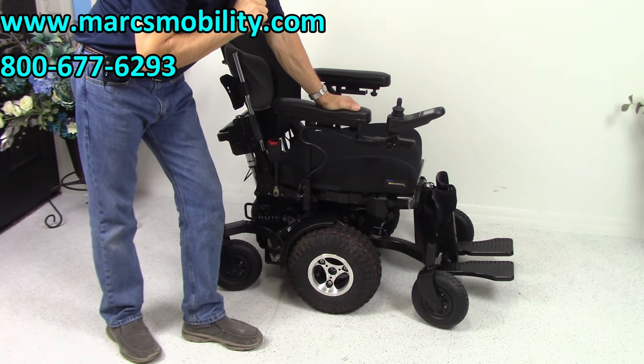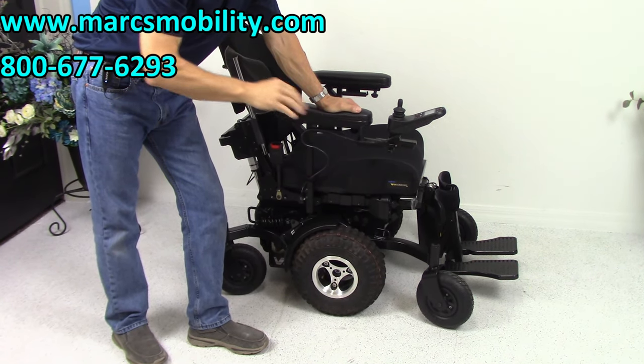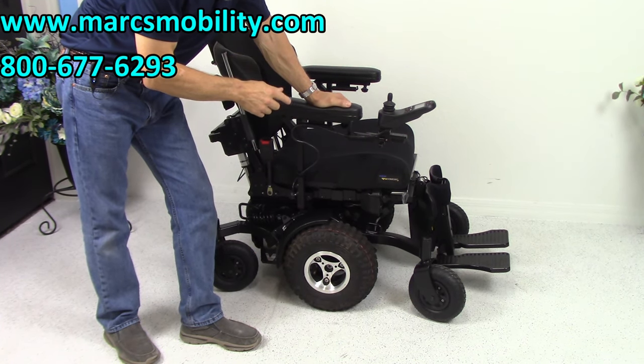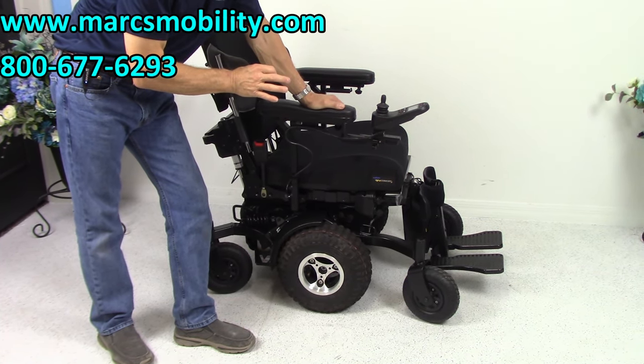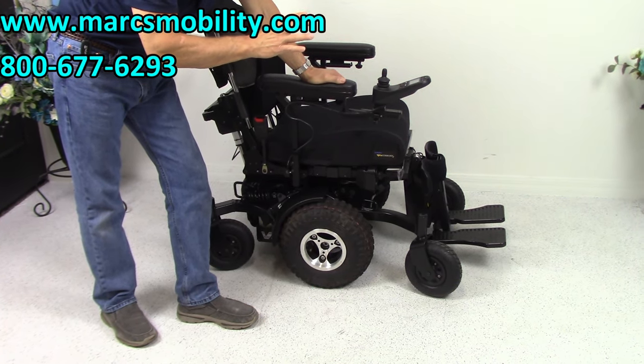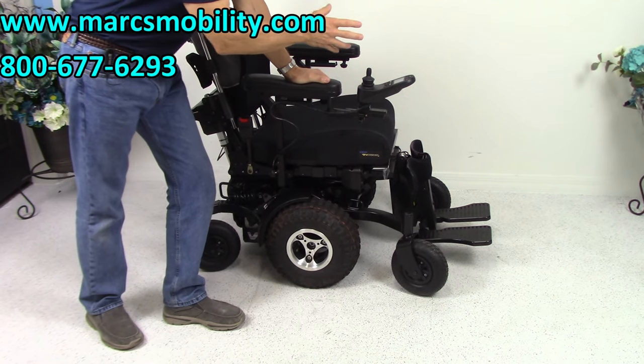It has a 12-inch seat lift, the electric tilt, the electric recline, and the electric leg. So this V6 Frontier extreme power chair has all four functions, and all of them have to be worked through the joystick.